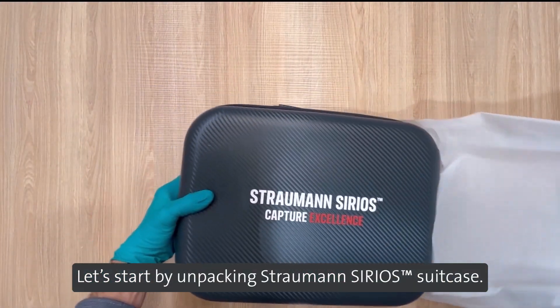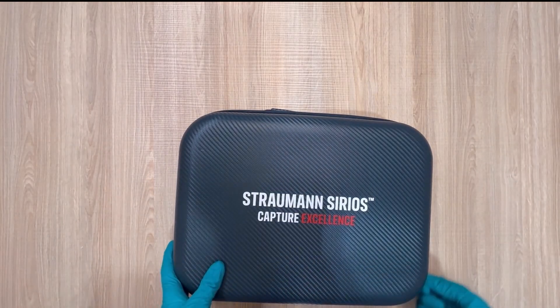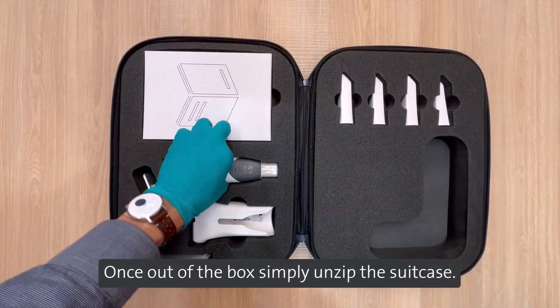Let's start by unpacking the Straumann SIRIOS suitcase. Once out of the box, simply unzip the suitcase.